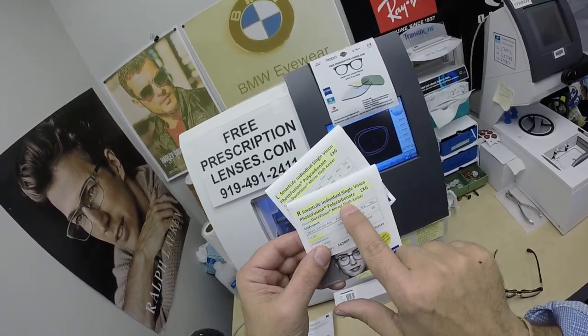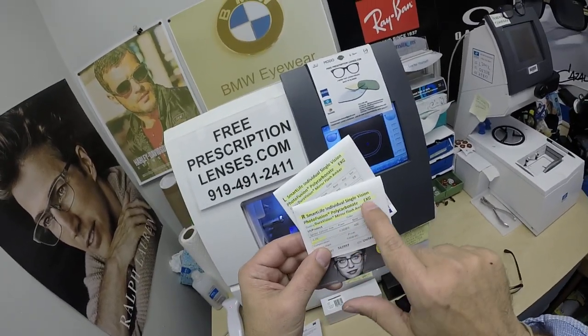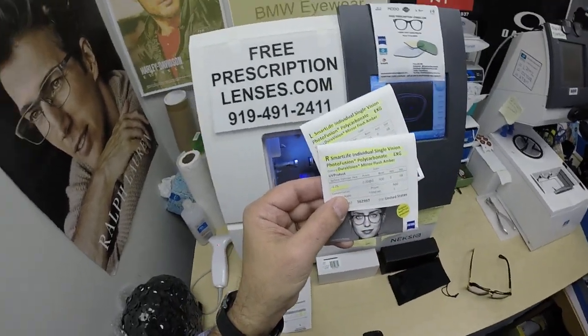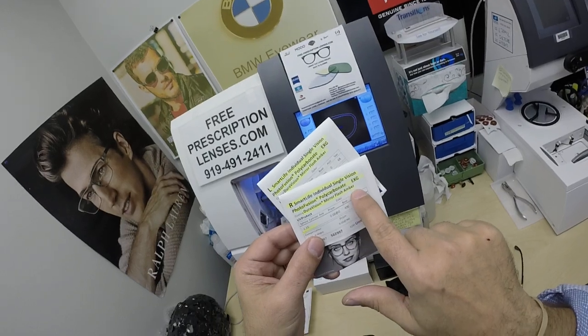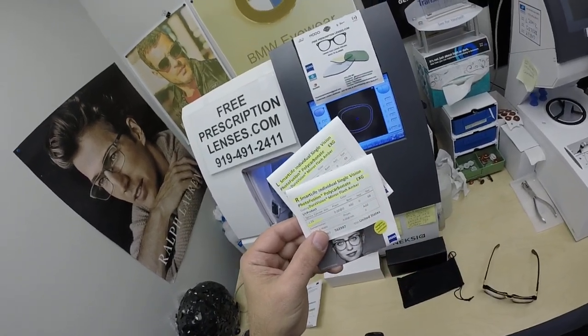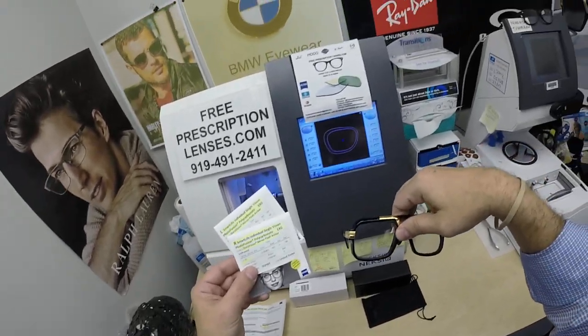He got the Photo Fusion in polycarbonate extra gray. I see polycarbonate Photo Fusion extra gray — they do things backwards. They're German, maybe it's the metric system. Anyway, he got the DuraVision mirror flash amber, which I call the gold flash, because you're going to see these lenses turn gold when I activate them under the light.